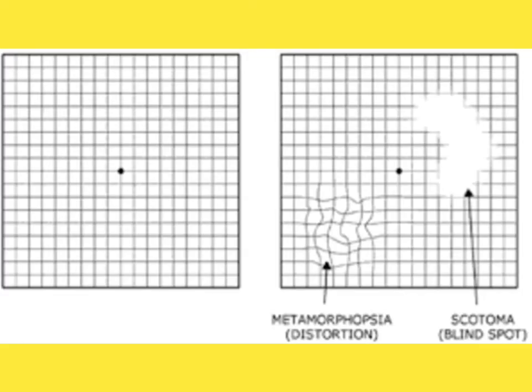These squares have a measurement of 5 millimeter, so that you can detect any type of macular abnormality with the help of this card easily. Okay, another, oh sorry, so here I gave you some examples of abnormalities that you can have and what can be the possible diagnosis.